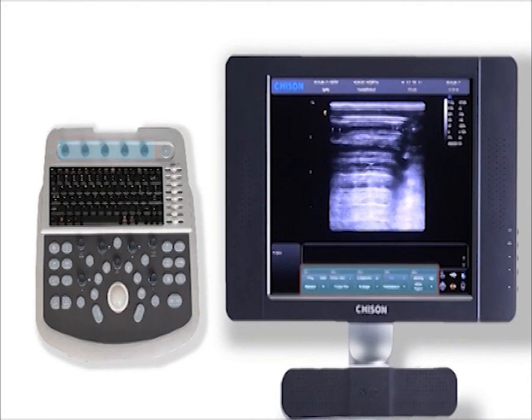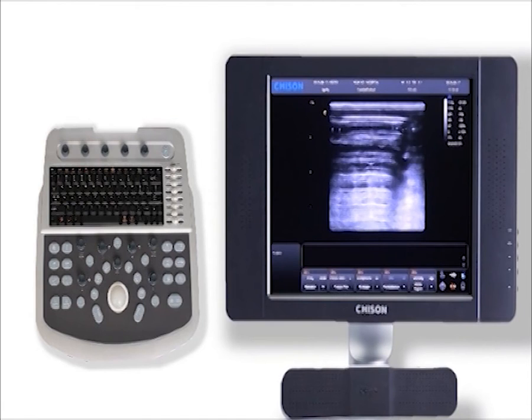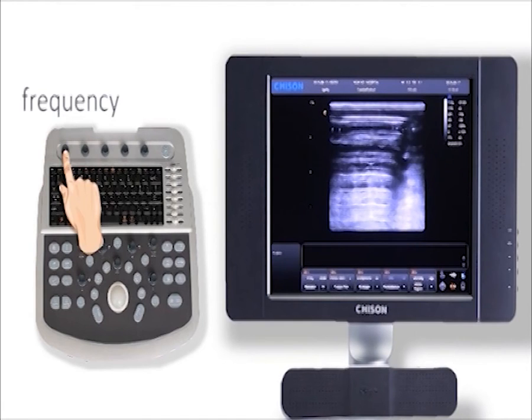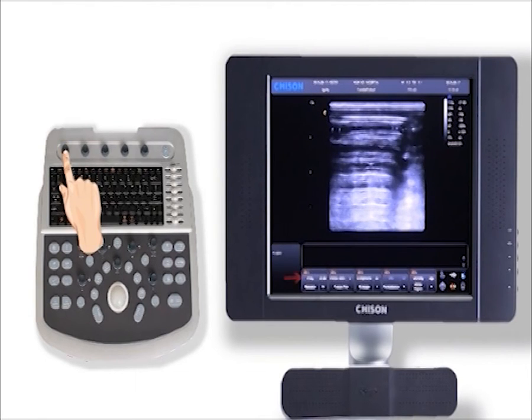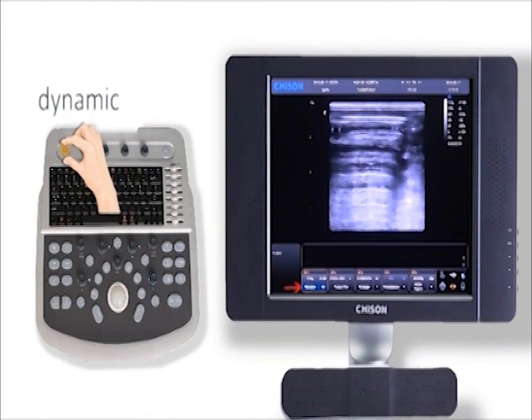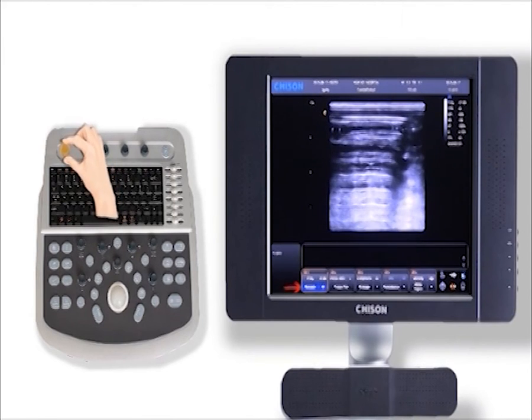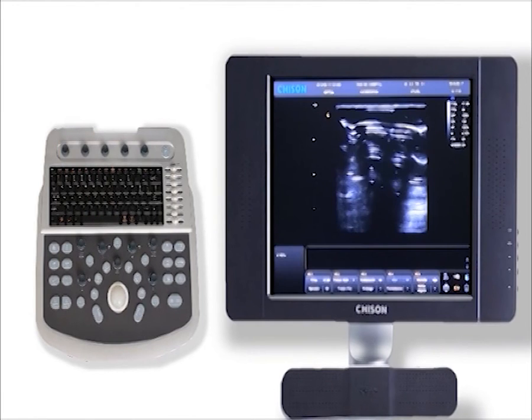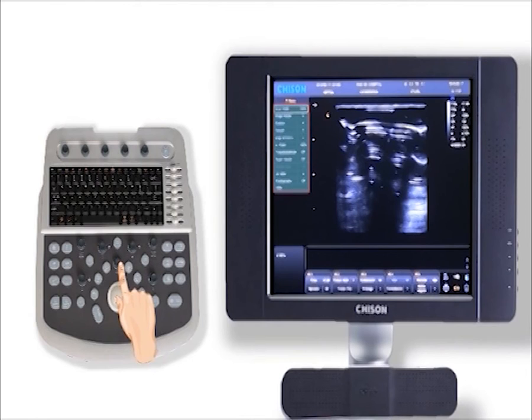There are some shortcut keys here. We have two lines of parameters. Press the first knob to adjust frequency according to different body size patients. The second line parameter — we can twist the knob to adjust it, like dynamic range. Also, we have some other parameters accessible by pressing the menu button.